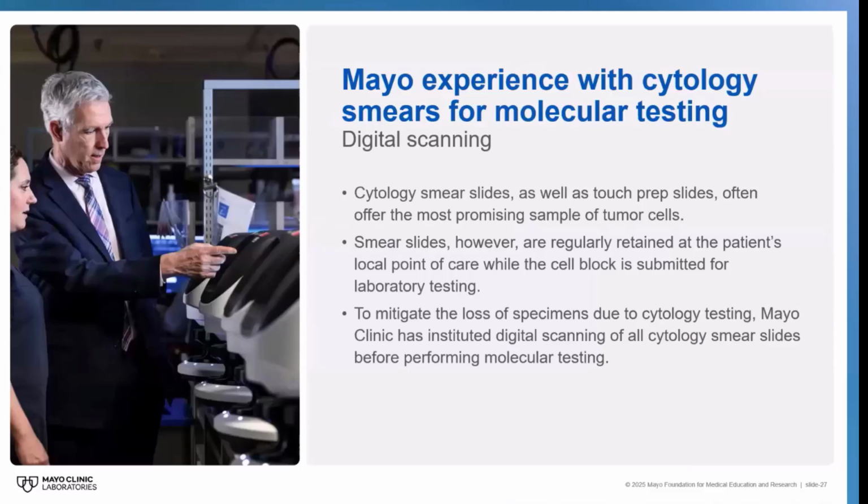Traditionally we think of cytology smears as diagnostic material. They are kind of legally bound because they are diagnostic material and evidence. Traditionally, we are reluctant to use them because when we use a cytology specimen, we dissolve every cell on the slide and test them, and the slide is used up and can no longer come back. Unlike a cell block, where we cut into the block and still have diagnostic material left. So initially many people had concern that if we use them, we don't get them back, and then there's no material, no evidence left.